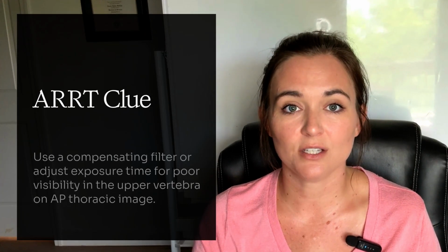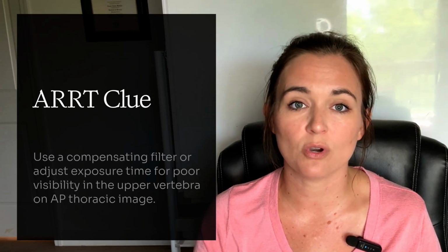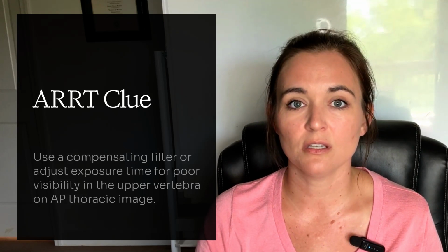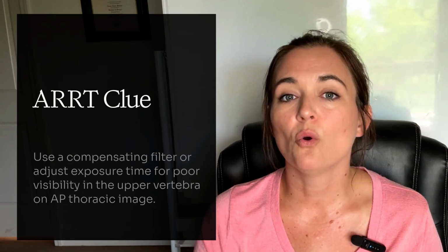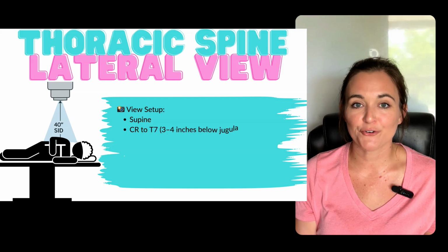Here's an ARRT clue. If the question says your AP thoracic image shows poor visibility in the upper vertebra, but you're within collimation, the best answer is likely to use a compensating filter or adjust exposure time. All right, lateral thoracic spine. Now let's move to the lateral view.